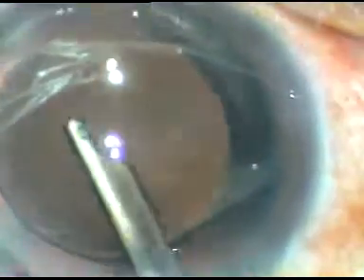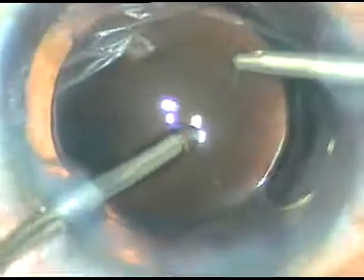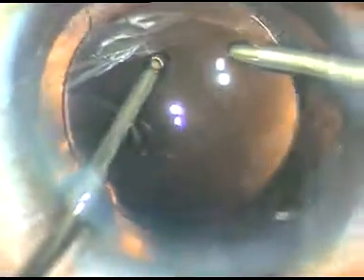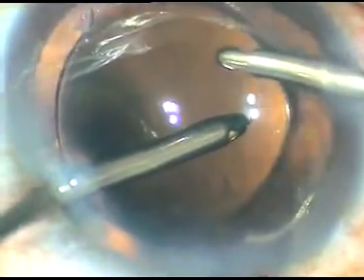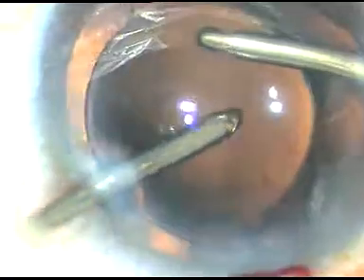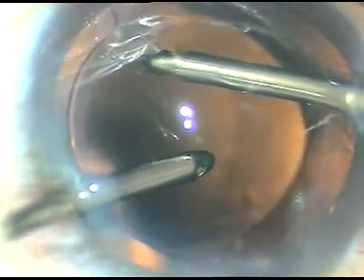Now viscoelastic substance has to be removed very thoroughly. I use Simcoe cannula as well as bimanual irrigation aspiration to remove the viscoelastic substance thoroughly out of the anterior chamber and from the capsular bag. That's it. The case is done.